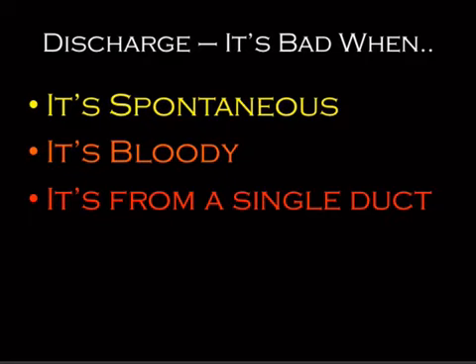Now the contraindications for any procedure are always testable. You would not do a galactogram if the patient was infected, because you're going to be squirting stuff in there. You're not going to perform a galactogram if they have mastitis. If they're unable to express a discharge at the time of the exam, because you have to know which duct you're going to cannulate. Or if they've had surgery to the nipple before, and that's going to make it basically impossible to cannulate the single duct. So you perform it, you put just a little bit of contrast in there, you take mammograms, and if you see filling defects, then typically perform a wire localization at that time, and then send them to surgery to have that excised.